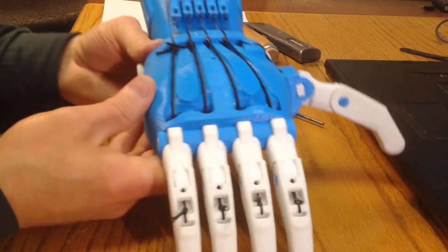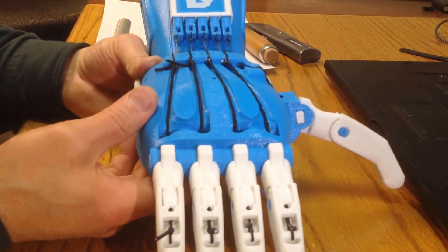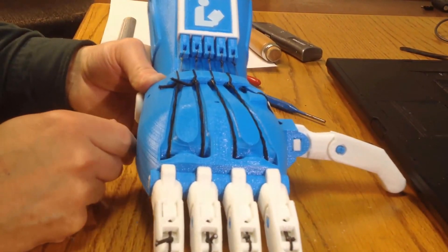And that is a hand that's going to be used for demo purposes at a local library, hence the library logo. Here we go.